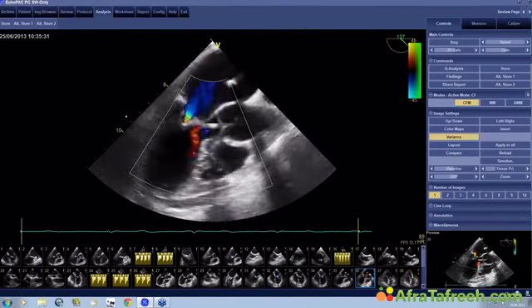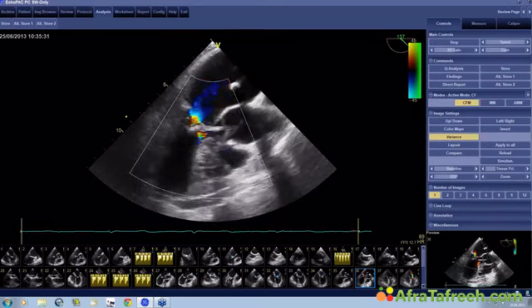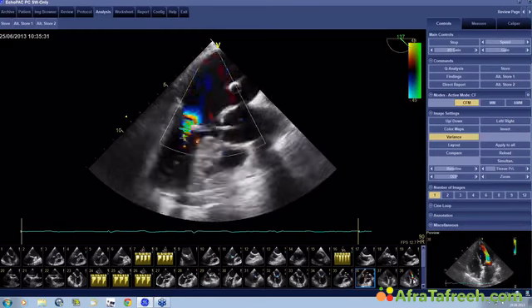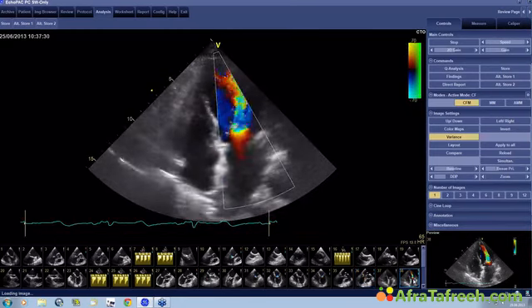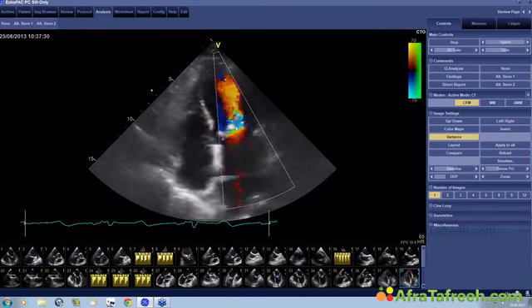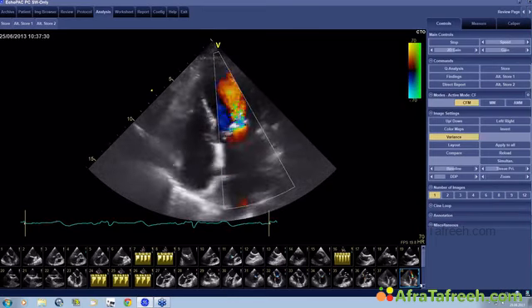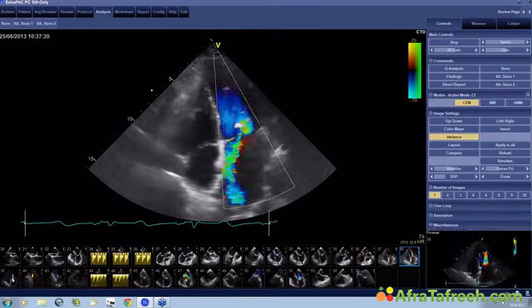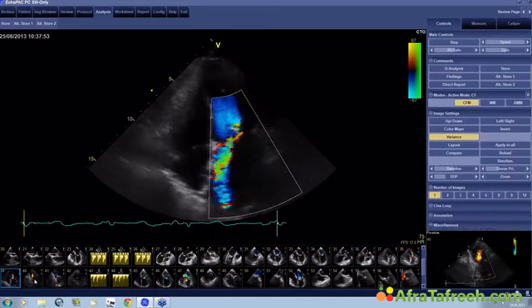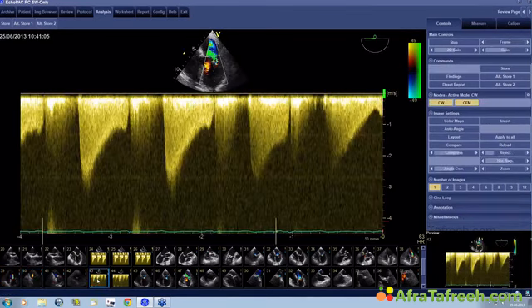I just see from your comments that many of you also noticed that what you have here is simply very severe mitral regurgitation. So while on the table, I wanted to take a second look at the regurgitation with transesophageal echo, and this is with transthoracic echo, sorry. And this is the jet we have here. Remember, she was not easy to image, but no question that the regurgitation is also severe if we look at it from the outside. What about the gradients?